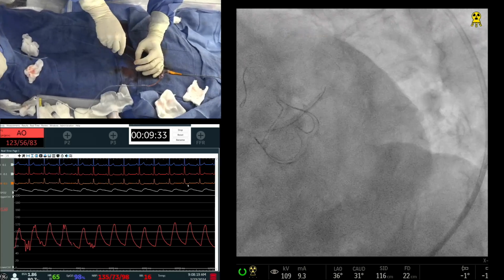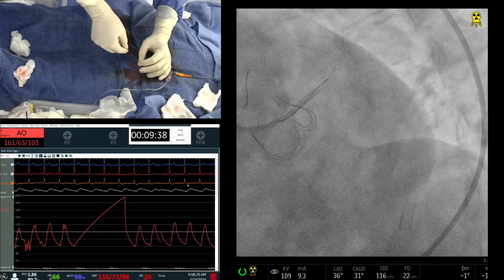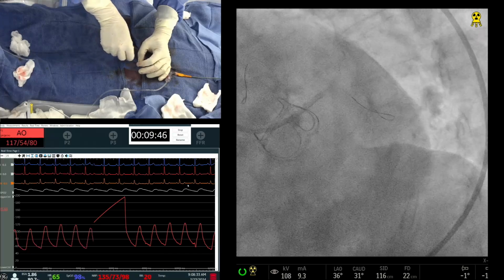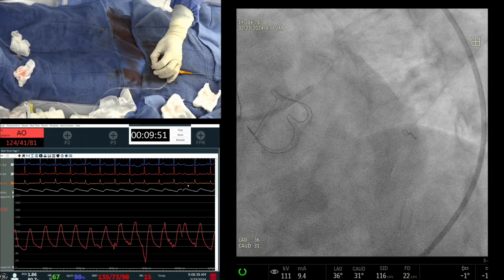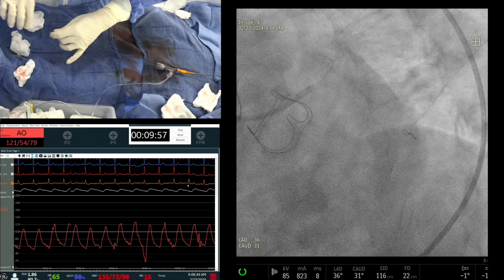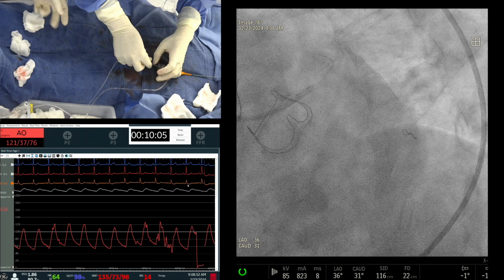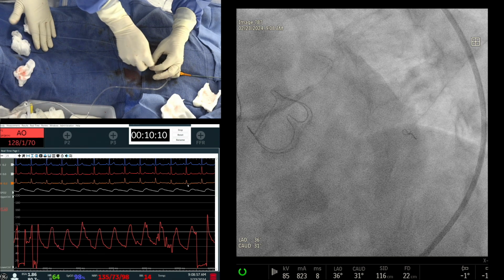So clearly I say that once the IVL has started, there are 2 lesions where we should be careful and do it only if must. One is the diagonal and second is the angulated circumflex like this. If there's too much calcium you need to do it, but these are the 2 lesions which have the highest perforation rate with the Rota. And our goal, and that's what we are looking into in our database, is that what IVL has done is decrease the complication of atherectomy. Why? Because you go with a smaller burr and you are not doing it in areas which are more susceptible for perforation.